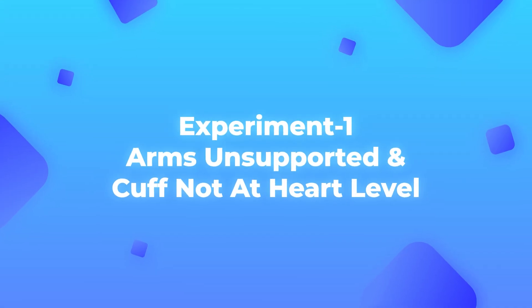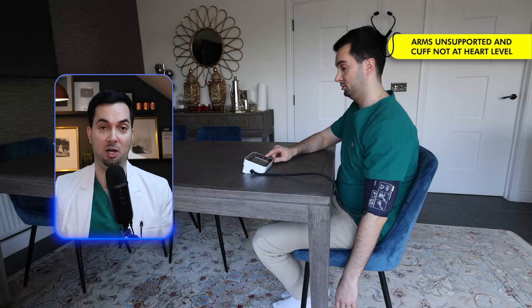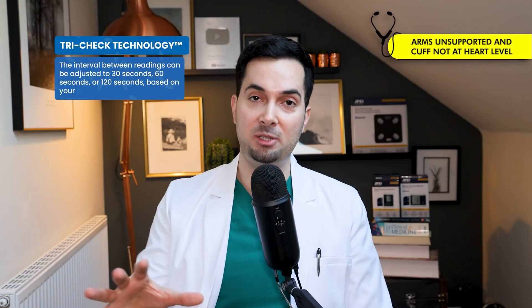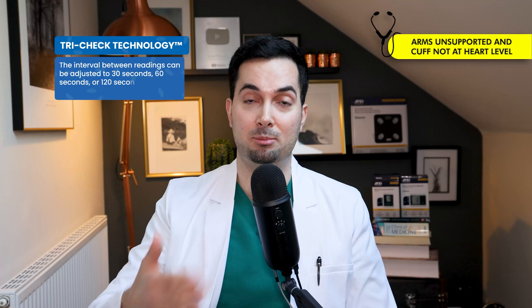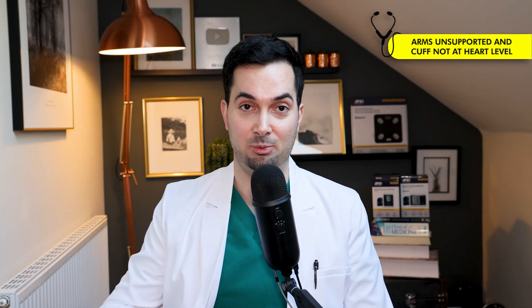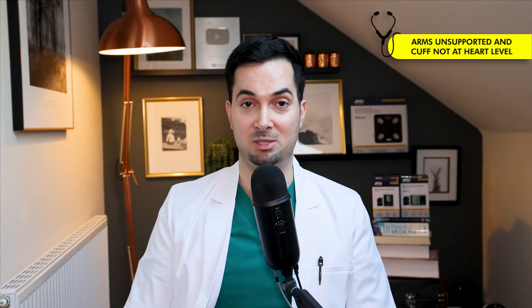Experiment number one: we're going to take the blood pressure reading with my arm not supported and the cuff not at heart level. You'll notice in the video where I'm taking the blood pressure that these positions are incorrect. Again, for all experiments I'm using the Try Check technology — three readings with 60-second breaks, averaged. This mistake is quite common; I see a lot of patients whose arms aren't fully supported or at heart level, so really do think about whether you're making that mistake.